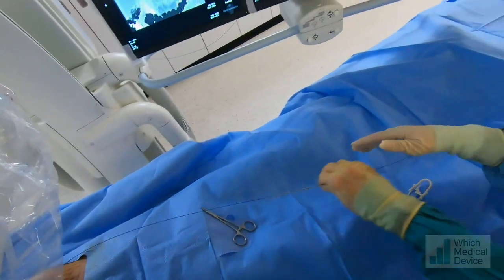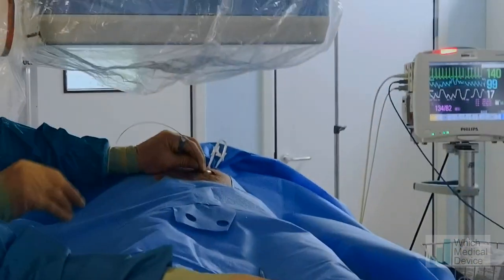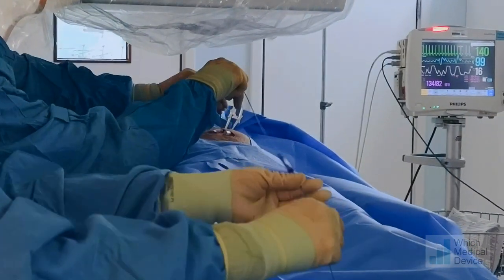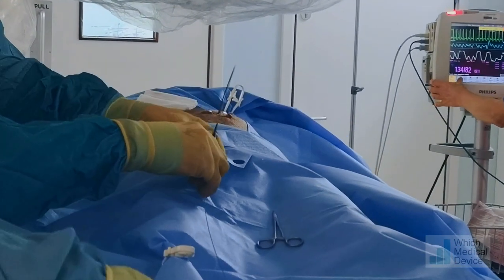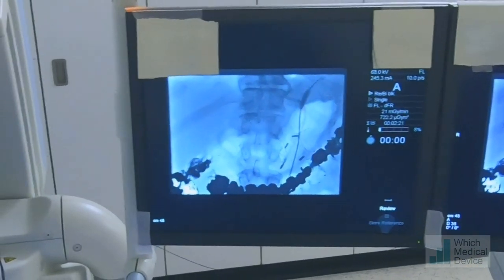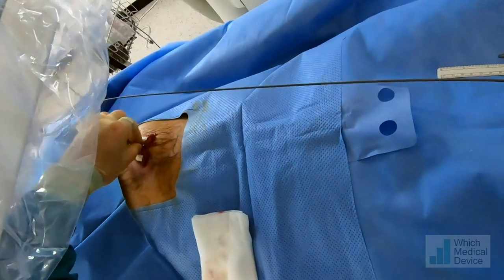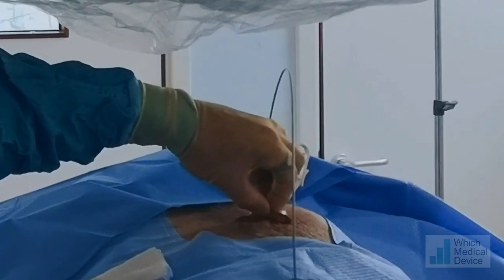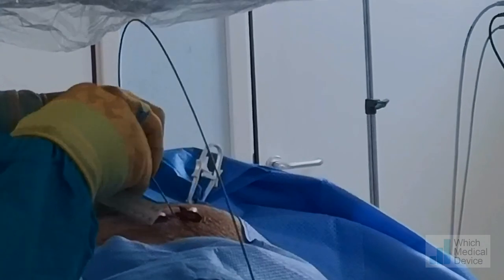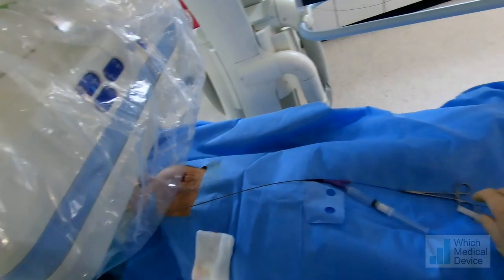Taking the needle out, we're now going to measure the length of our track using an angioplasty balloon. This is a 6mm angioplasty balloon — pushing that in over the wire into the stomach and inflating it. Now it's in the stomach; you can see it clearly. We pull it back, keeping the wire in, until it is snug on the inside of the gastric mucosa. Fixing position on skin, deflating the balloon, and pulling back — measuring the distance between the first marker and my fingers. That's the thickness of the anterior abdominal wall and the length of tube we need: 3cm.